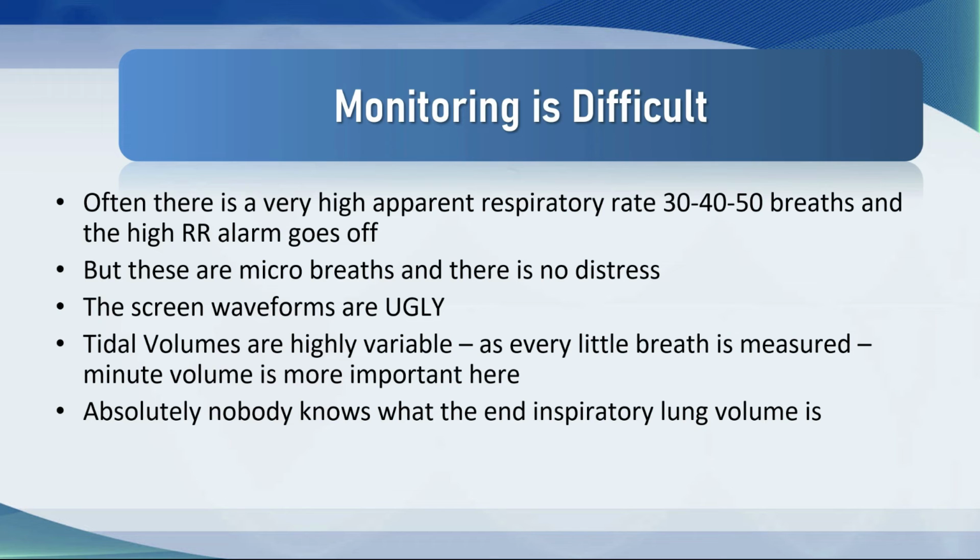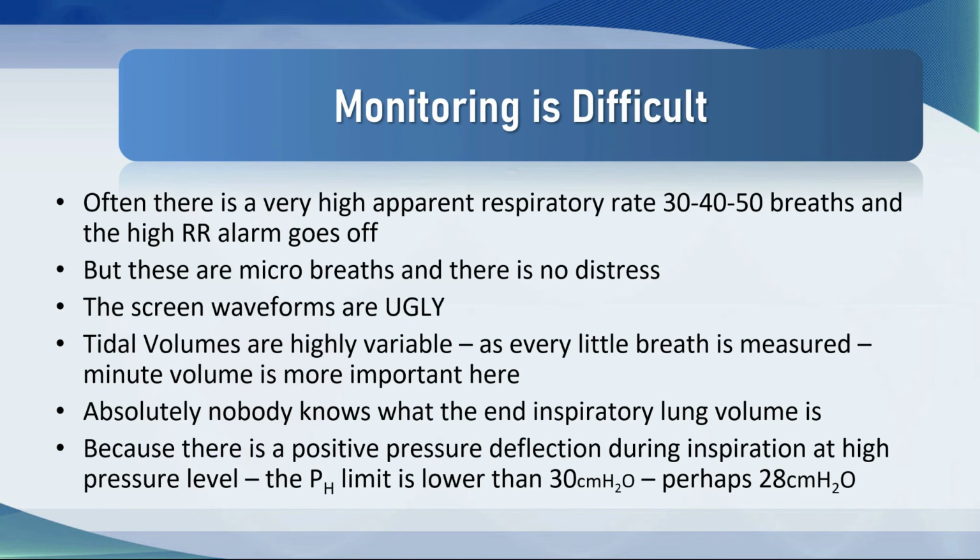Nobody really knows what the end inspiratory lung volume is, and this is potentially problematic because there is a positive pressure deflection during inspiration at the high pressure level, and you have to be a little bit cautious about how you set that high pressure level.